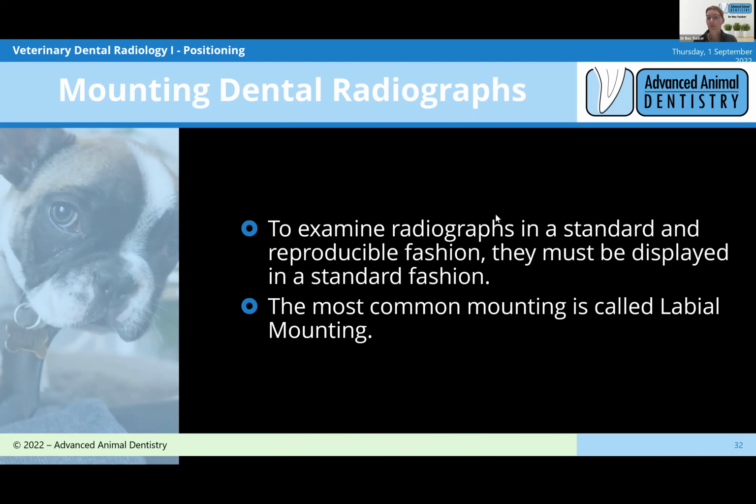To answer the other question from before, about how to get good images of the rostral premolar teeth: sometimes you've got a really tight symphysis where it's hard to get the plate down, or if you are using the more rigid DR plates, you go back to using the bisecting angle technique. So in the one we showed you of the canine tooth, where we were taking that more lateral shot, you'll often also get really good images of the rostral premolars. Essentially you put the plate on top of the tongue, so it's not rotating too much in that horizontal plane, and you'll come in at an angle like that to the mandible.